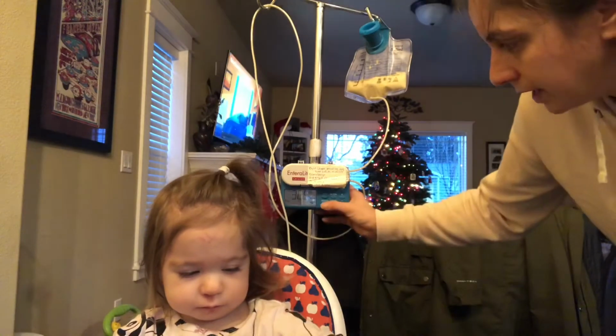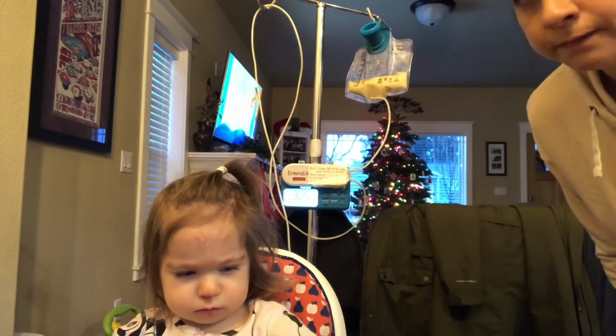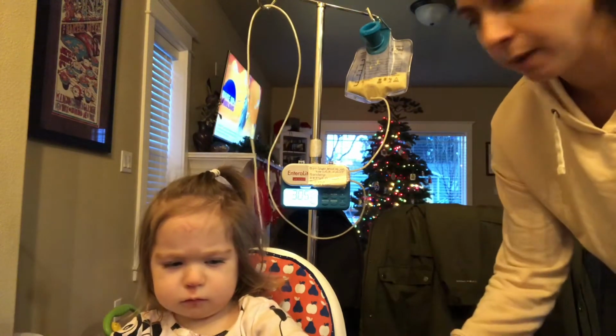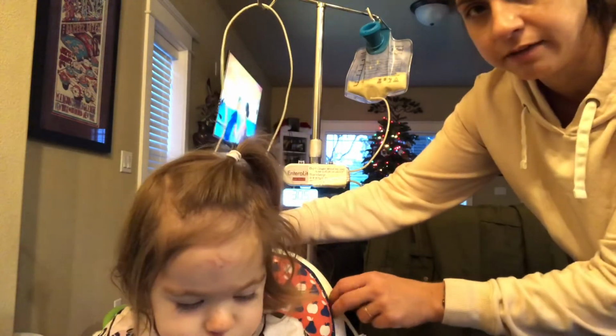And then you push the run pause button. So you just push run, and now she's started. She's unclamped, and it will run at the proper rate for her. And we usually just set it kind of back there, just so it's not heavy.